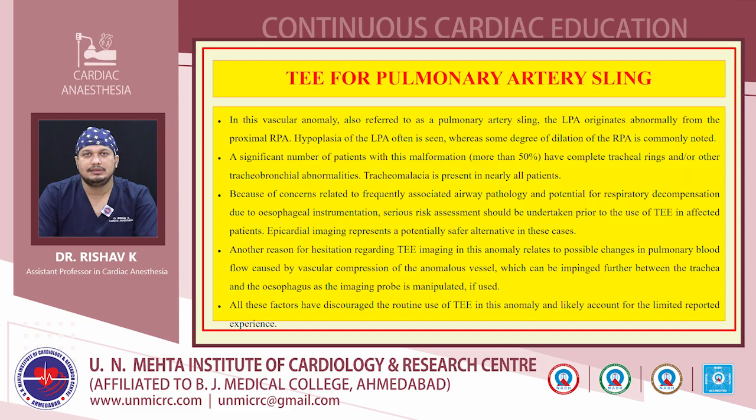Because of concerns related to frequently associated airway pathology and potential for respiratory decompensation due to esophageal instrumentation, we should always undertake a serious risk assessment. So this is very important. We should always undertake a risk assessment prior to use of transesophageal echocardiography in affected patients.